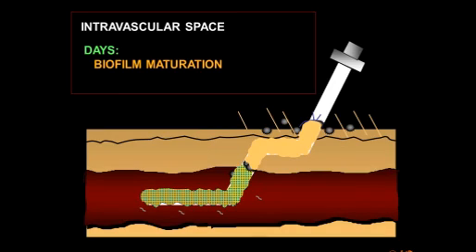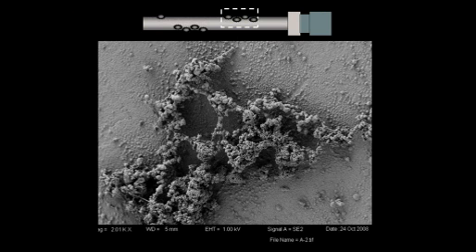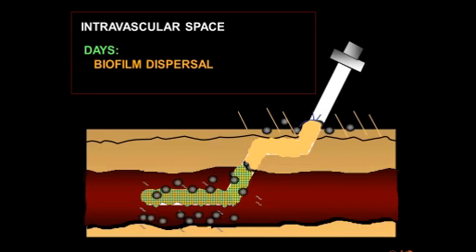Now, within days, remember this catheter went in with some bacteria, both in the subcu space as well as attached to the catheter surface. Whatever bacteria were there will build a biofilm. Within about 5 days, here you see bacteria attached to the extraluminal surface of the catheter, embedded within this proteinaceous material. These will then mature, and also note, as in this picture, this is a biofilm developed on the external surface of a catheter that is not embedded within fibrin. They don't really need the protein to attach. They will attach to pretty much any surface. So this is a biofilm, a large colony, not involved with fibrin. At about 5 days or less, these biofilms will produce and release large numbers of cells, and these can be floated away into the bloodstream.